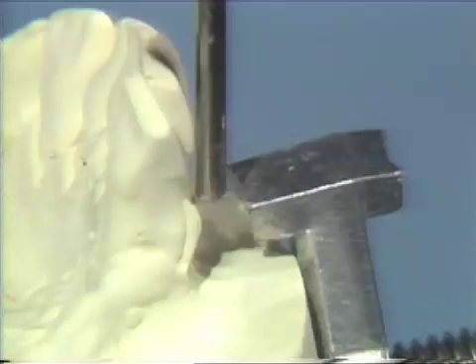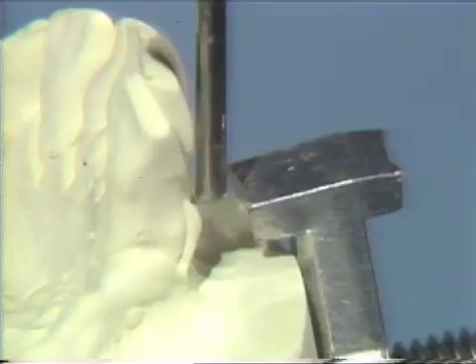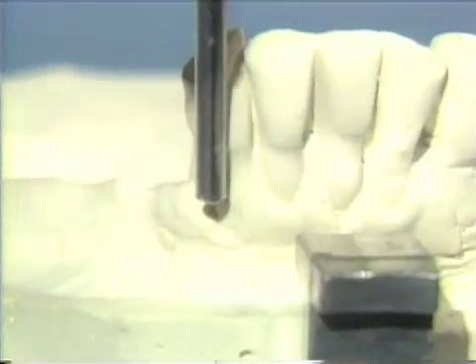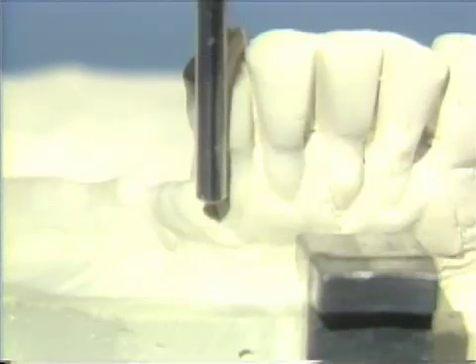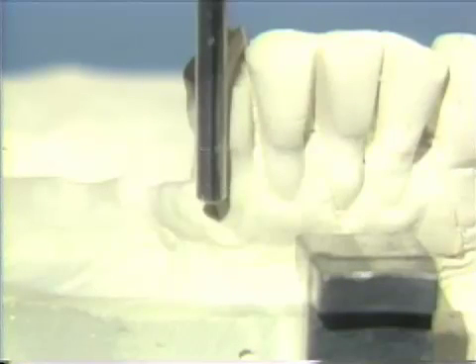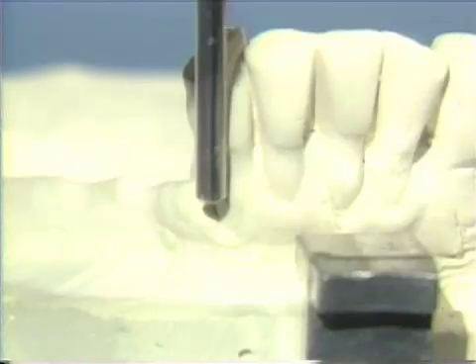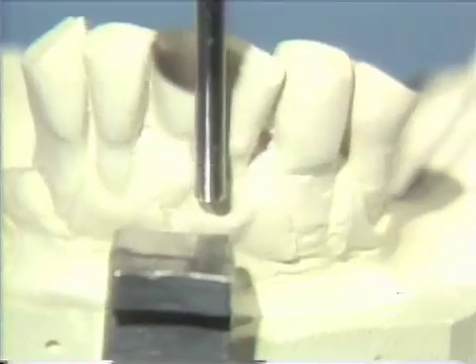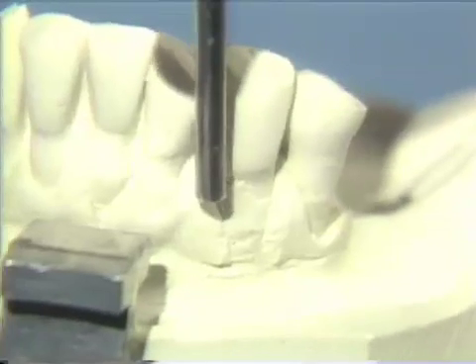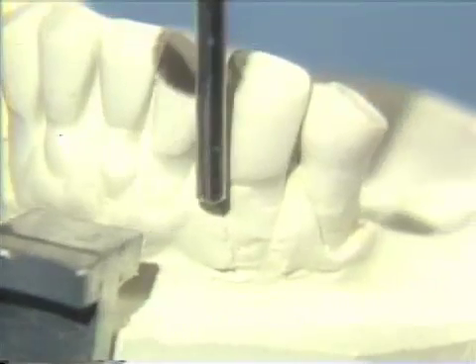In addition, the height of contour on the buccal surface of tooth 25 will be lowered. The distal of tooth number 25 at the incisal will be reduced for aesthetic purposes due to replacing tooth number 26 with the proposed line of draw of the partial denture. Numbers 22, 23, and 24 will be modified on the labial for aesthetic reasons, and the incisal edges of 23, 24, and 25 will be reduced for patient comfort.